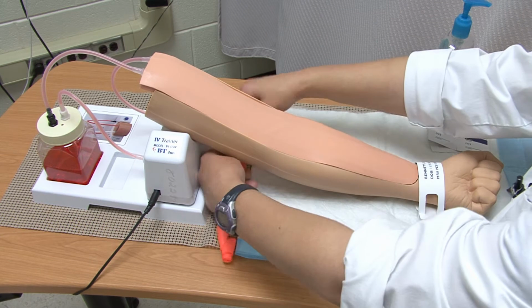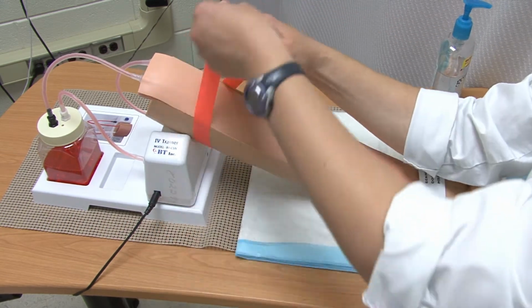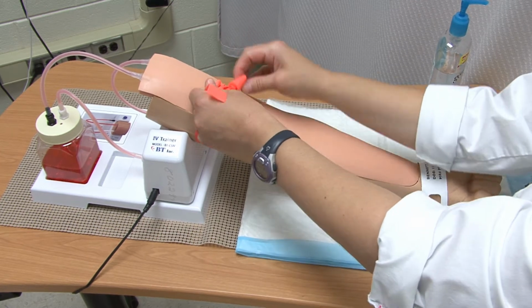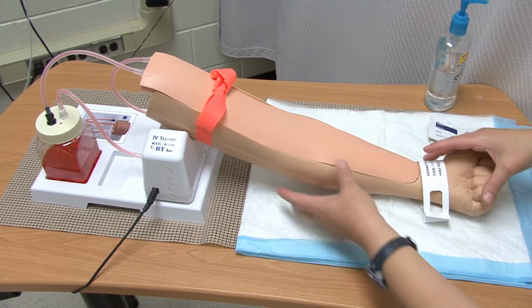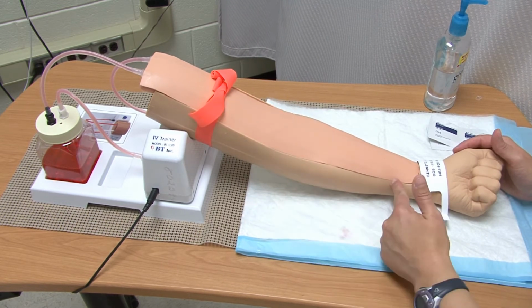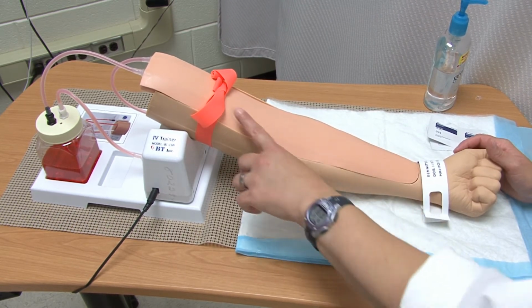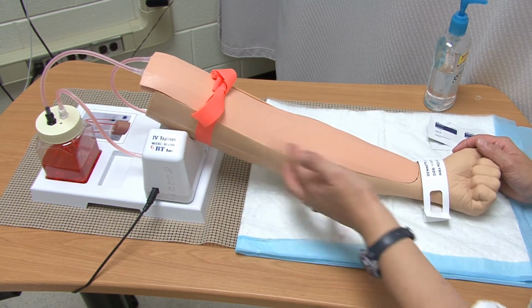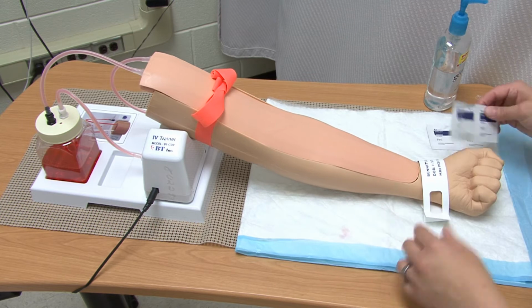For now, I'm going to tie the tourniquet all the way up above the patient's antecubital area, which is at the bend of the elbow. This is going to help engorge the veins so that I can see them. You usually don't want to leave your tourniquet tied for more than about a minute because you could potentially cause an issue with circulation to the arm.